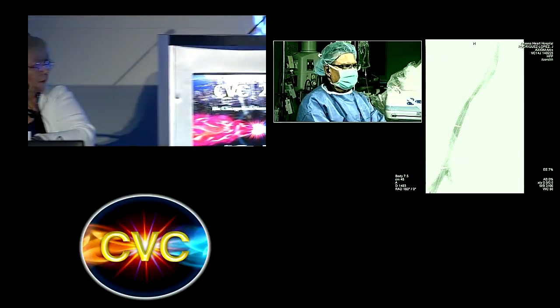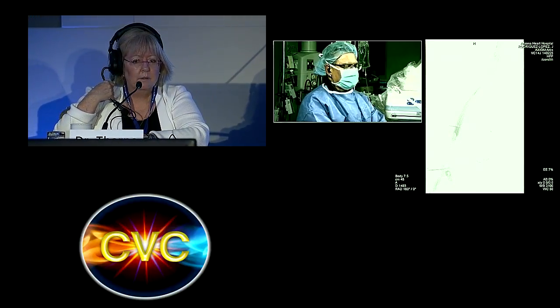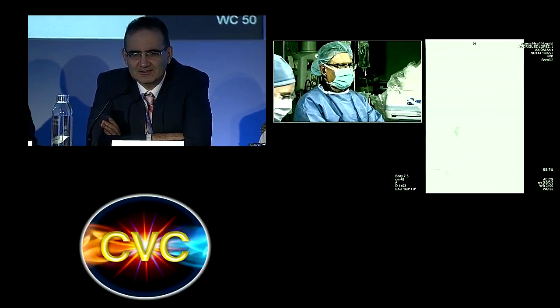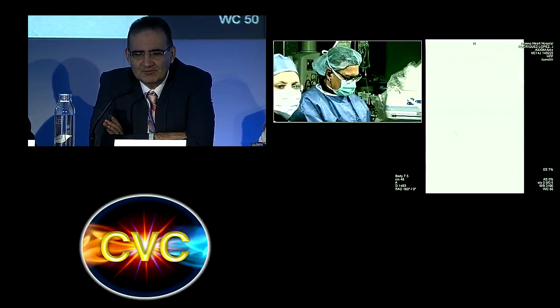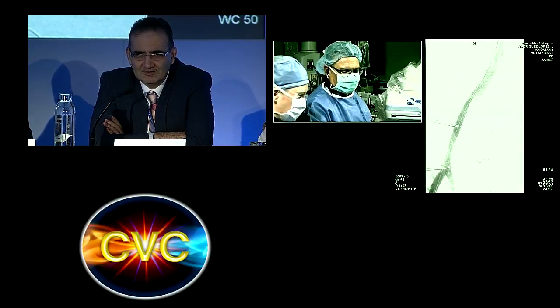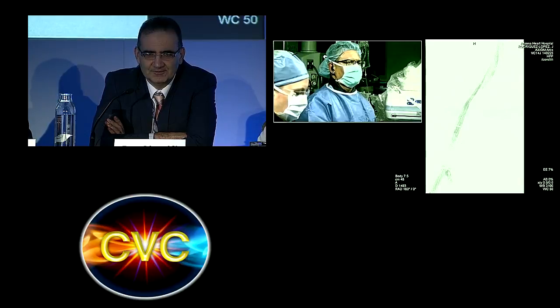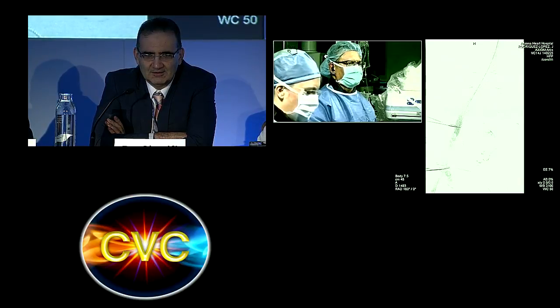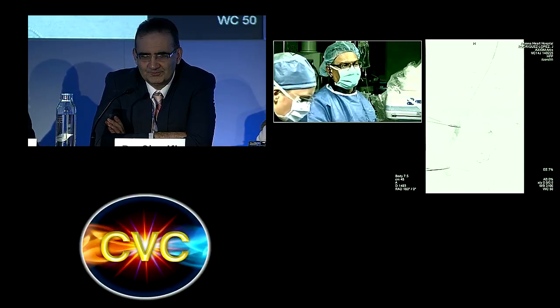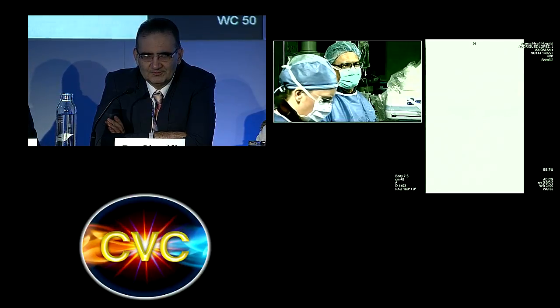What do you think? Yeah, I think, Julio, just proximal to where you stented, just before the distal common iliac vein, before it bifurcates, there may be a lesion there. On your IVUS even, that was clear. Yeah, that's the area where the hypogastric is coming off. We can dilate it. Let me have the 14 millimeter balloon again. Let's touch that area right there.